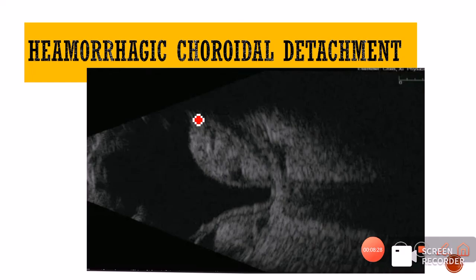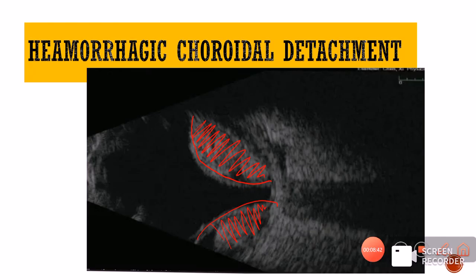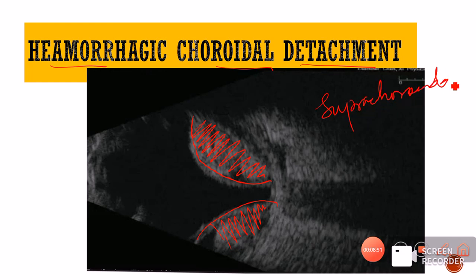In a hemorrhagic choroidal detachment, we again have dome-shaped elevations, but the difference from the serous type is that the echoes inside are much more numerous. Therefore, this is a hemorrhagic choroidal detachment, which can also be called supra-choroidal hemorrhage — supra-choroidal hemorrhage and hemorrhagic choroidal detachment are the same term.